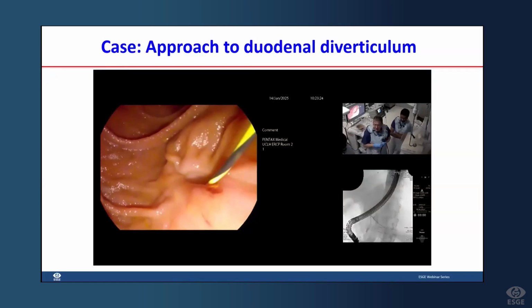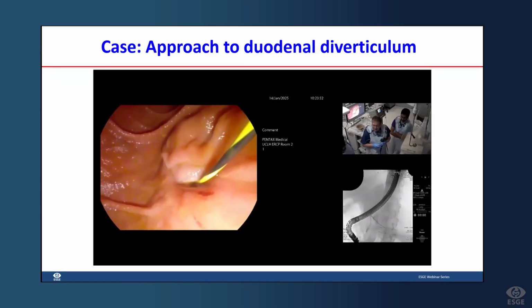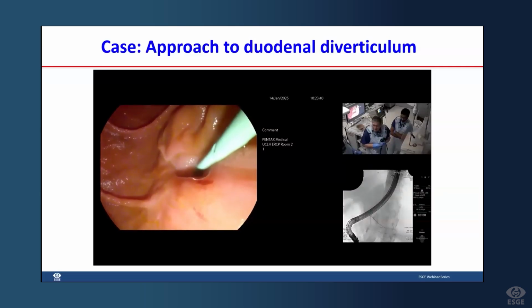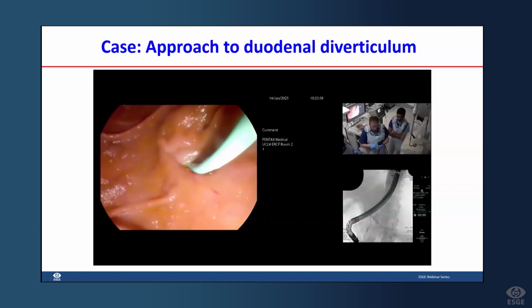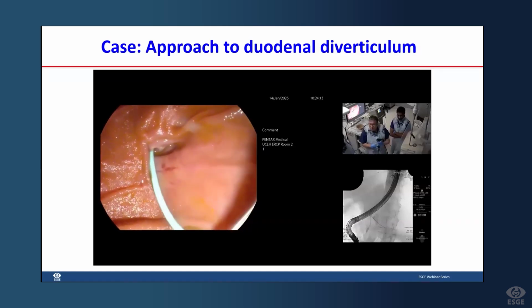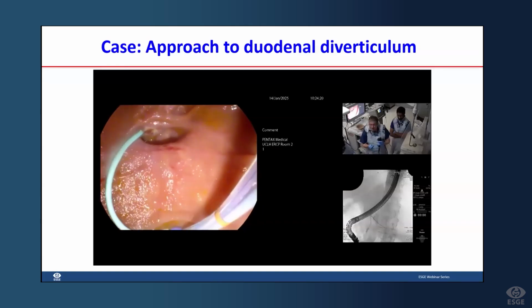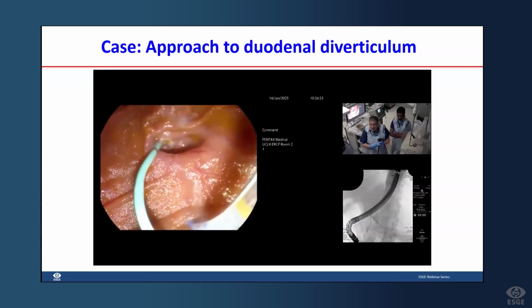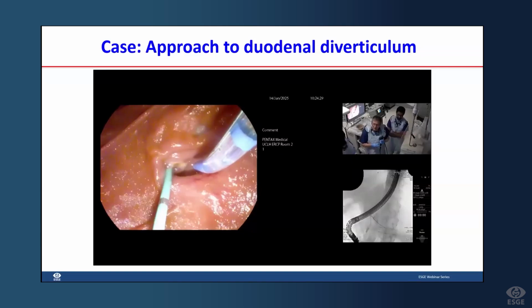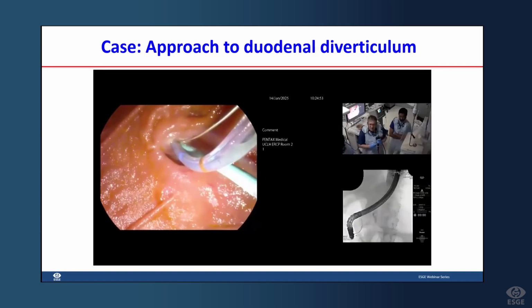You see it's completely disappearing in there now. The problem is that I don't have good runoff, and I'm not terribly happy about the more proximal end of the wire, although it is ductal. Okay, so what I'm hoping is if this goes in here, I want to deploy the pigtail downwards. Perfect. Now, if I now release the wire. Okay. Now, the plan behind that is that hopefully, as long as the stent doesn't get carried out, I've opened that up a little bit. Okay, so there we go.